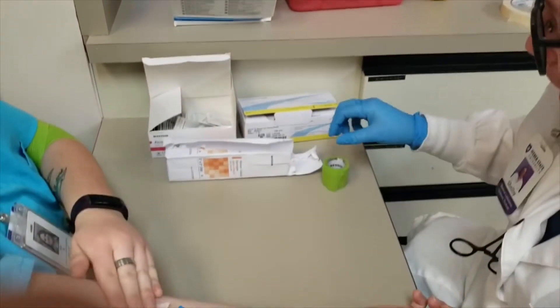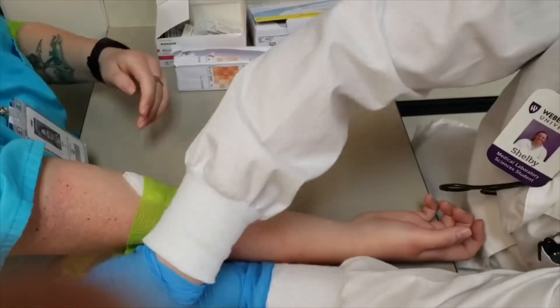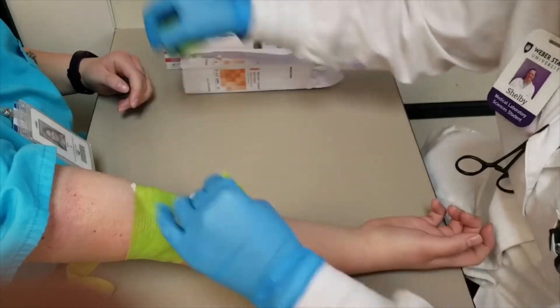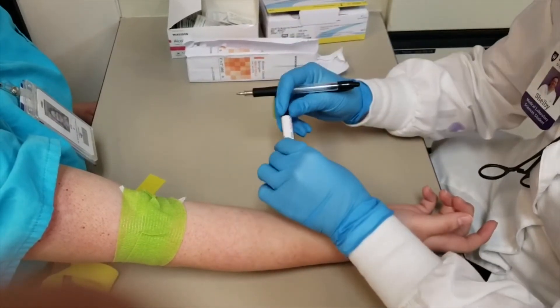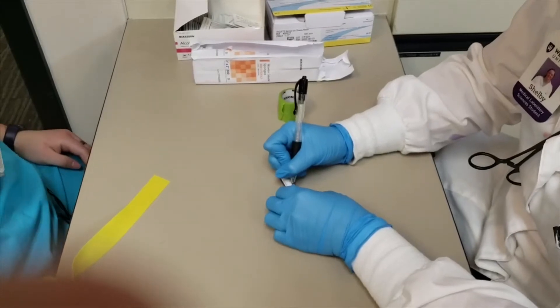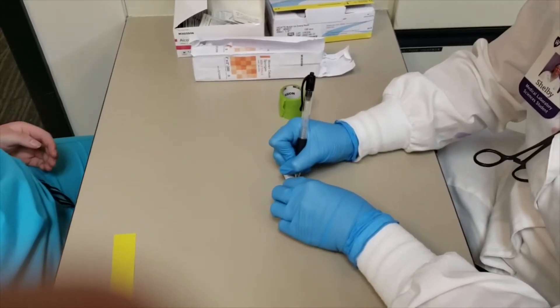Now you're going to have your patient hold the gauze while you wrap them. And then, while your patient is in front of you, you're going to write their name and date of birth on the tube.